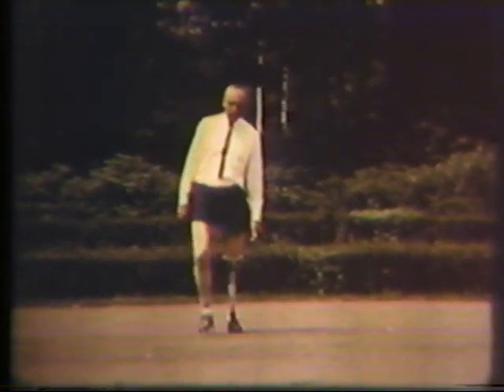This is probably one of the most common gait defects seen, and in the absence of the prosthetic causes just described, it can be assumed to be due to habit patterns. If the patient has been permitted to walk before developing good balance, he will lean over the prosthesis for security. Note that from the pelvis downward all things are unchanged from the normal — the prosthesis has not been changed — so we can assume this is truly a habit pattern. Retraining is justified but the end result must be guarded.